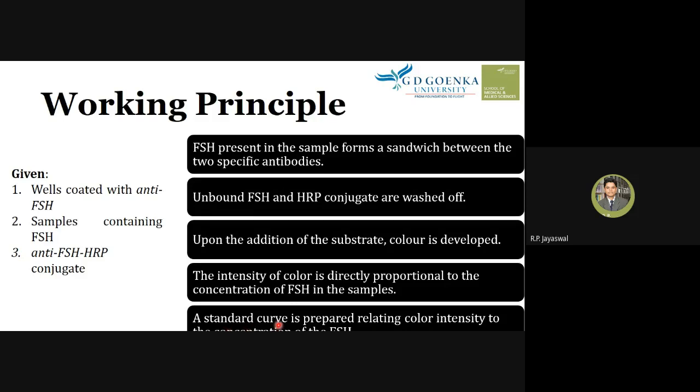Okay, and by measuring the FSH in the sample, we get the absorbance, but we need to know the concentration. So by knowing the absorbance, using the standard curve graph, we can find the concentration of FSH in that given sample.